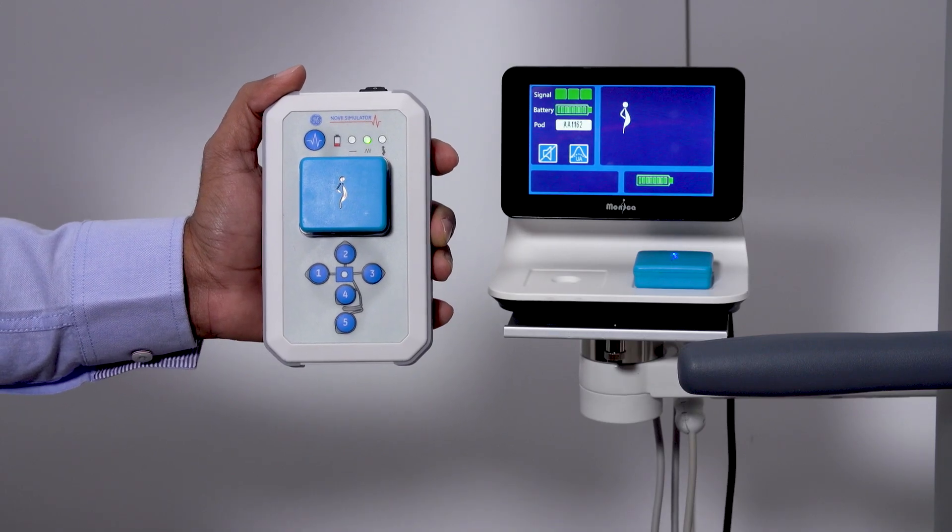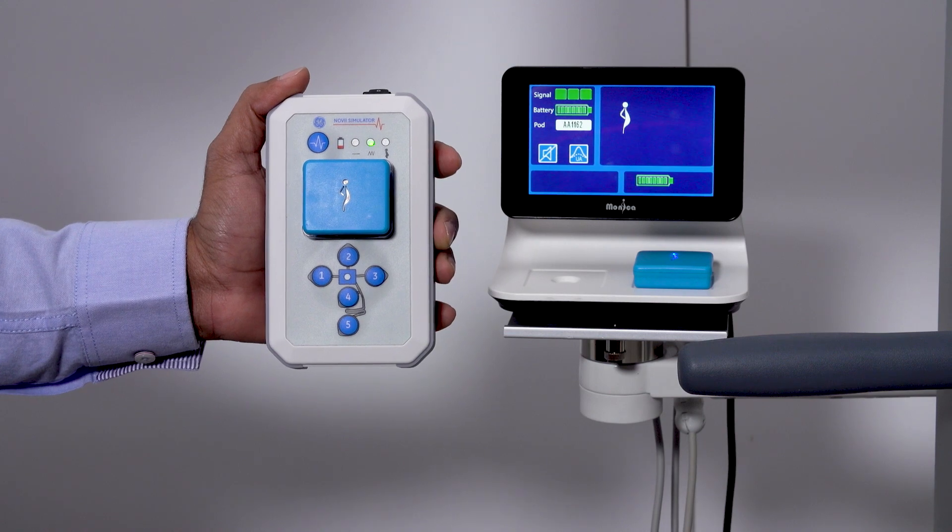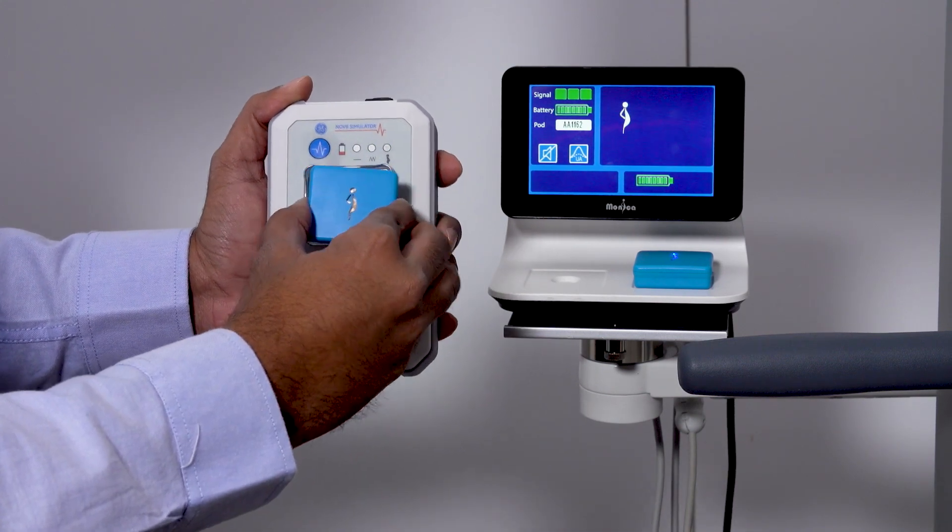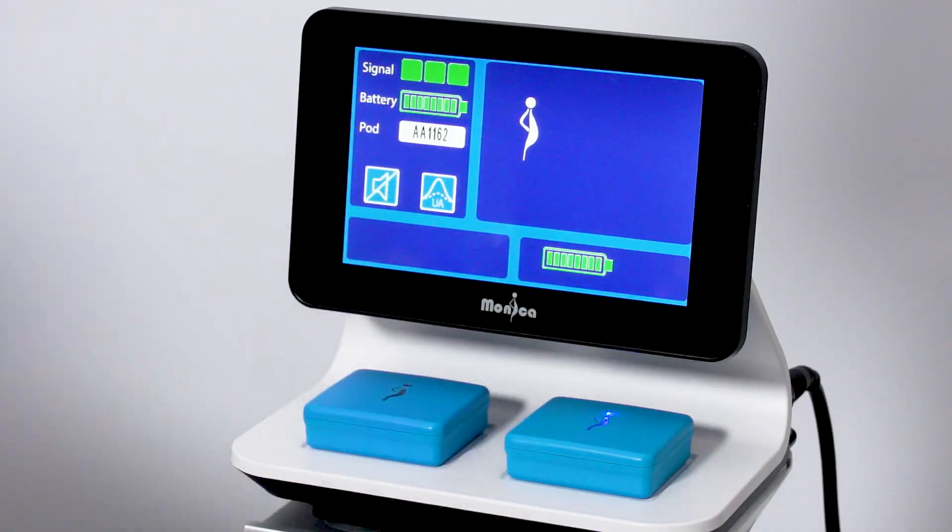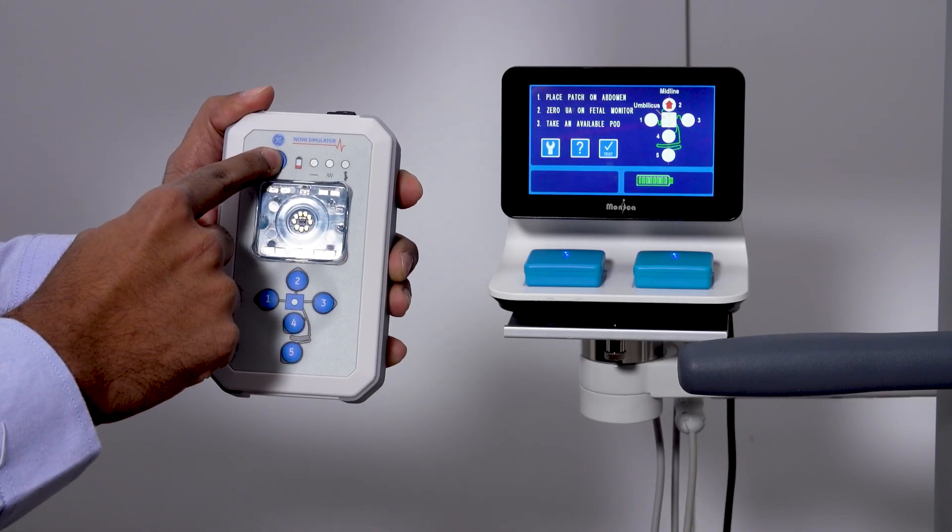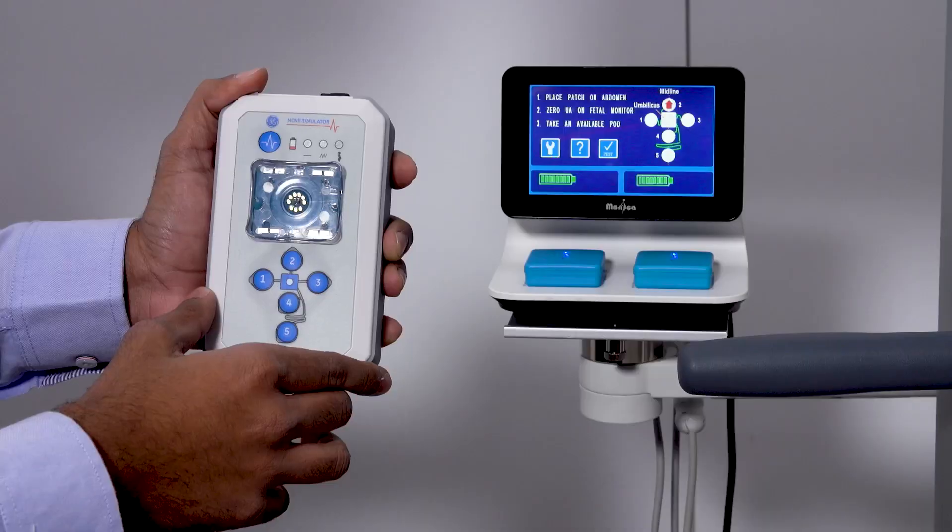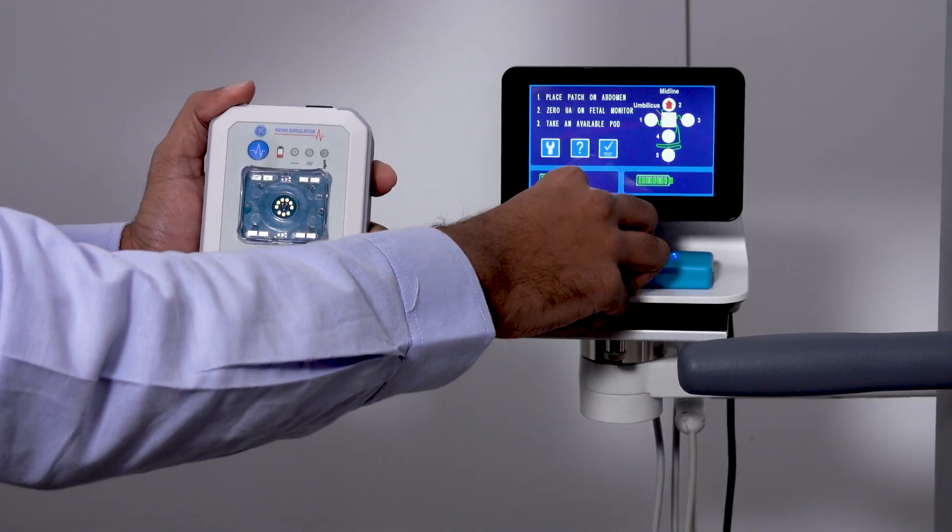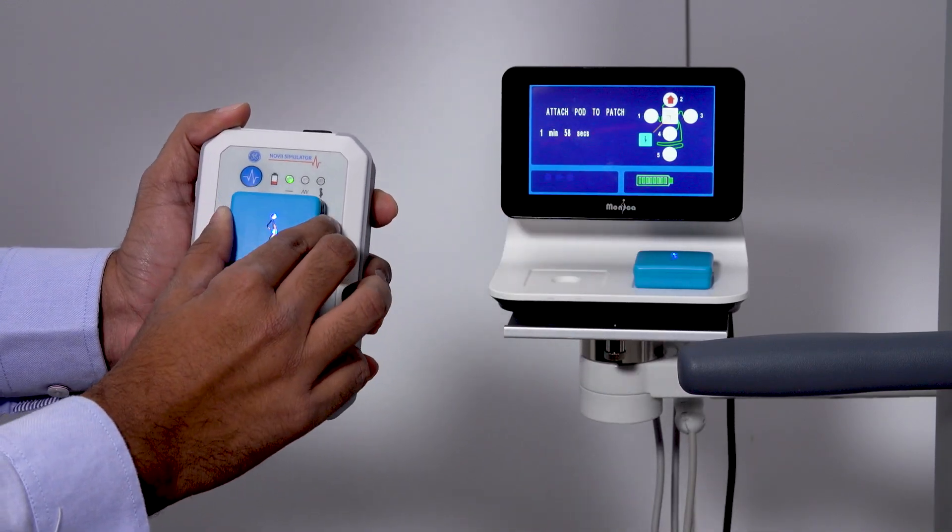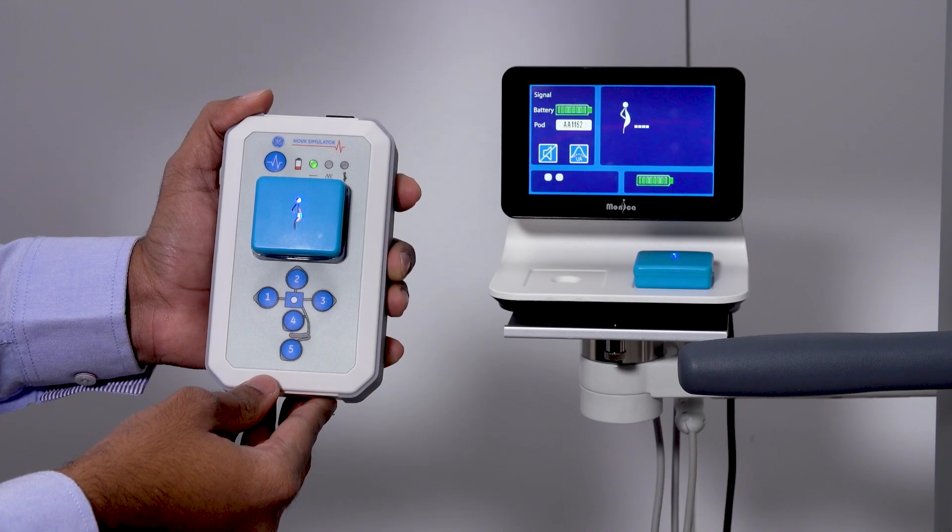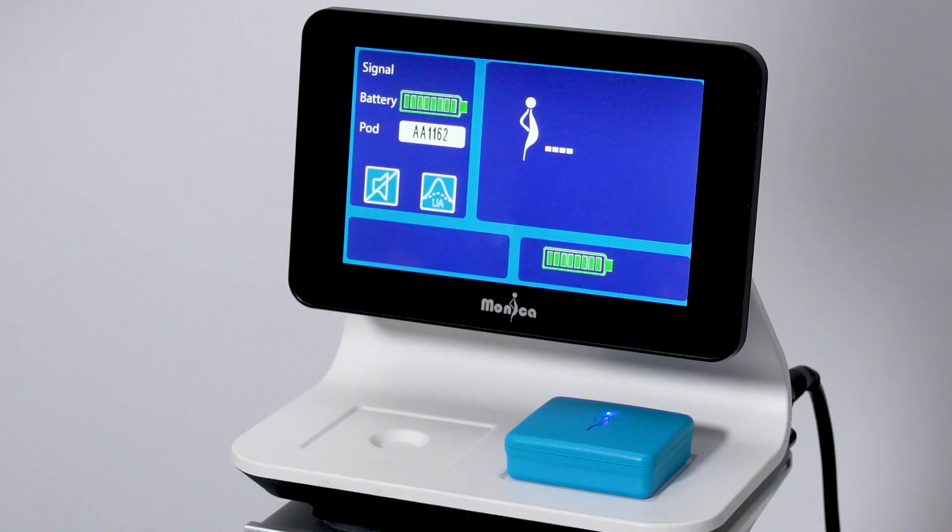To change mode to constant and restart the monitoring session, remove the pod from the simulator and put it back on the interface charging bay. Then change the mode. And once the battery indicator appears on the Novi screen, put the pod back in the simulator pod clip to start a new simulation. Once the fetal heart rate quality indicator turns green, the device is now in constant mode.